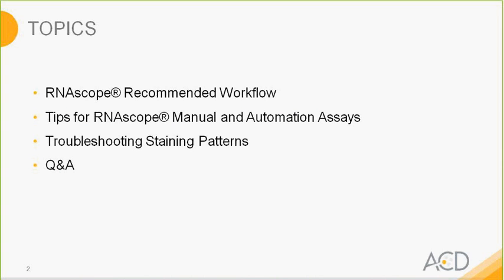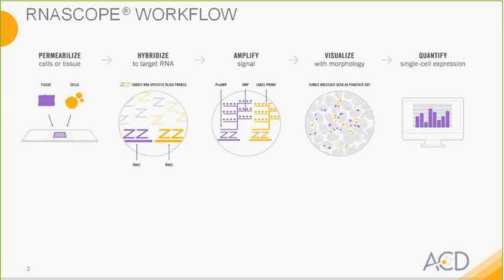For today's topics, we will be discussing the RNAscope recommended workflow, tips for RNAscope manual and automation assays, troubleshooting staining patterns, and we'll set aside room for questions and answers. As a general introduction, for some of you this is not new, but for people who are new to RNAscope, we'll just review very quickly the RNAscope workflow.